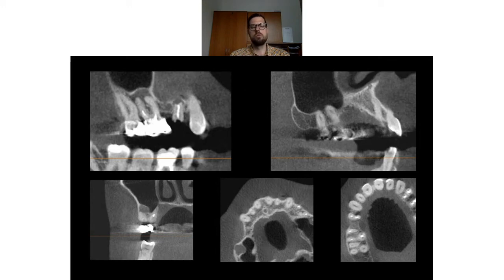First of all, because of the PA lesion of the 16, and the other thing is, as I said, always, for example, endo versus the implant. And I send it to my implantologist, and he can prepare for the implantology side. What does it mean? For example, he can predict if some additional procedures must be done, like additional bone or sinus lift and stuff like that, so that the patient is also informed beforehand what he can expect.